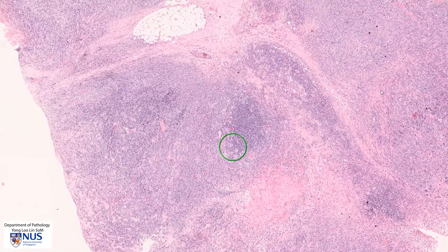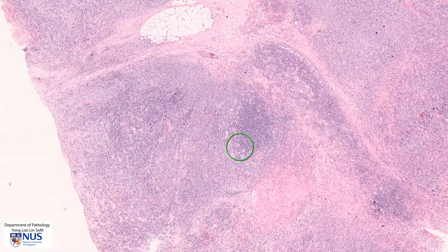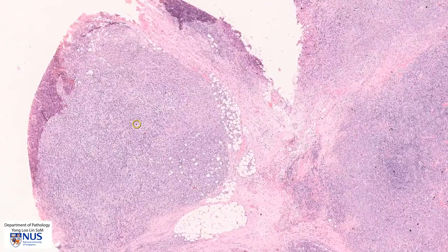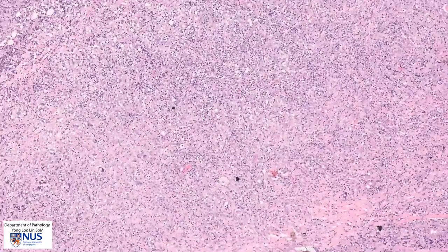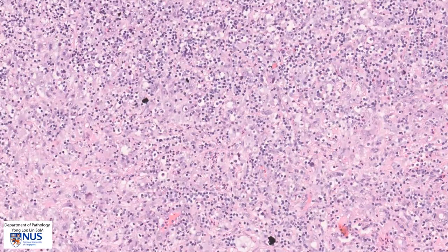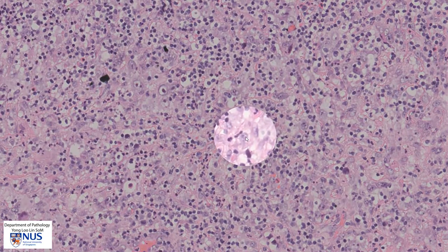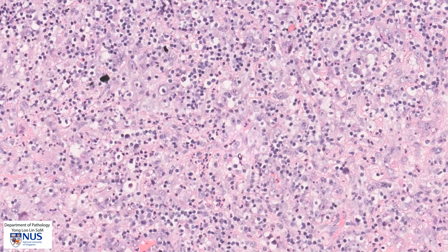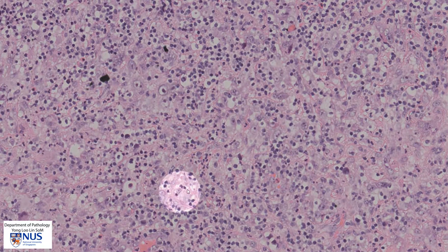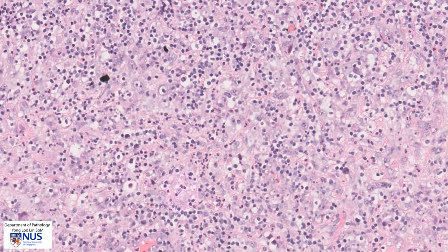Looking around, we can see that mostly the cells present are lymphocytes, and there are also some paler areas which are rich in macrophages. Here are some macrophages with abundant cytoplasm and quite pale nuclei. Here is another macrophage with abundant cytoplasm, and there are many small lymphocytes admixed with these cells.